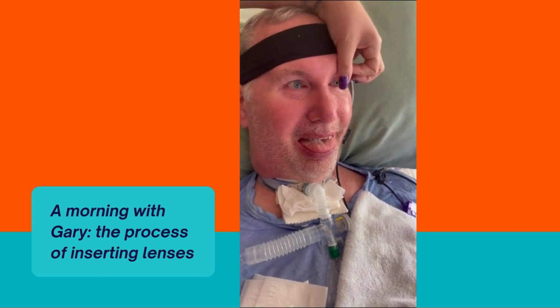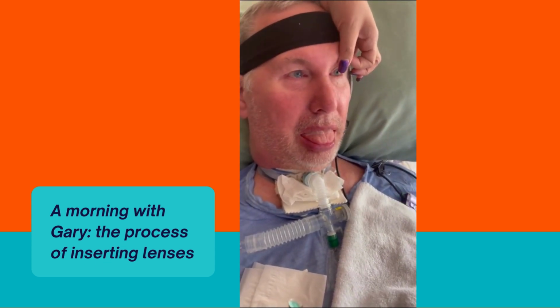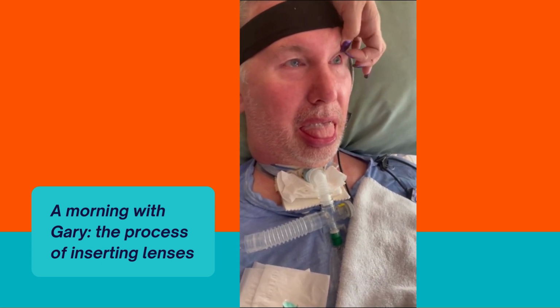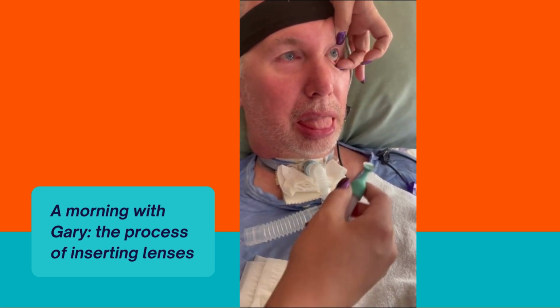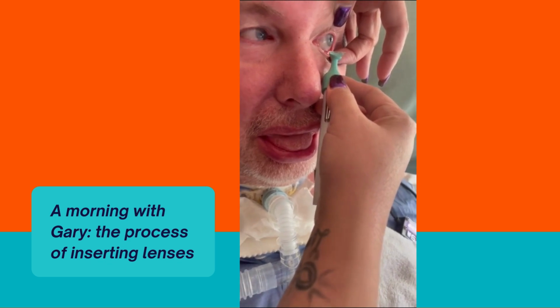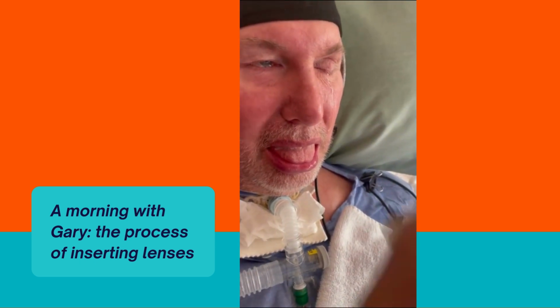Okay, we're gonna crawl. This side is a little bit more difficult because Gary has a lot of control in this eye. So of course his muscles are fighting against me. So we're gonna crawl up the same way. We're gonna hold with our thumb and we're gonna hold down. And we're gonna come over. Hold on, I tilted. That's me telling him I needed him to go to the left a little bit, and we're gonna flop in.